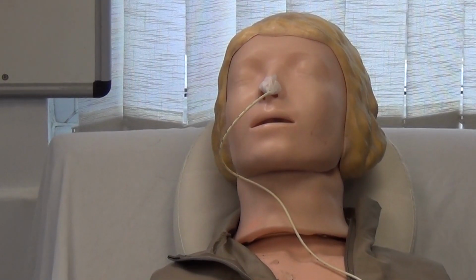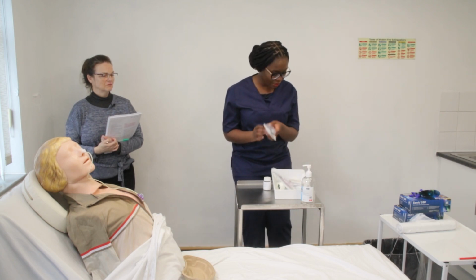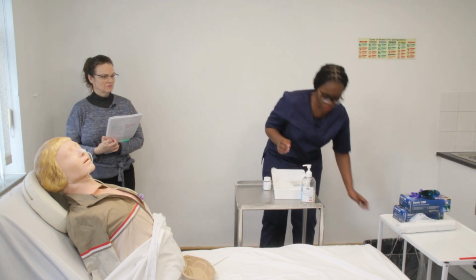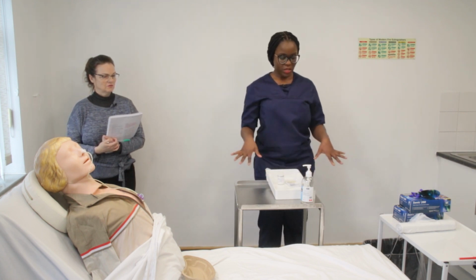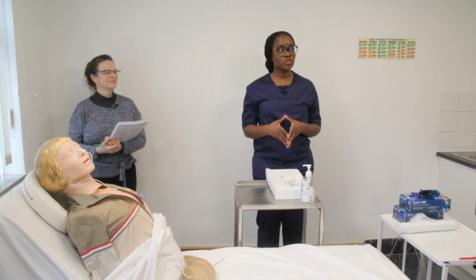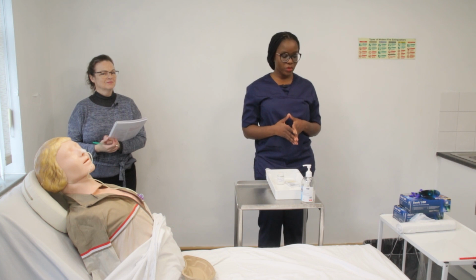Okay. All right, assessor, I'm done now. I'm just going to discard the syringe as well into the clinical waste bin with this one. And I'm going to clean the remaining items and get them ready for next use, and I'll go back to see Sue in about 30 minutes, and the receiver would be thrown into the clinical waste when she's done.